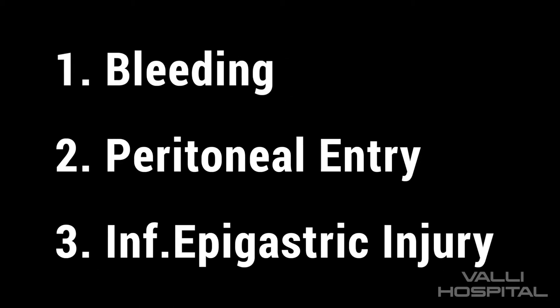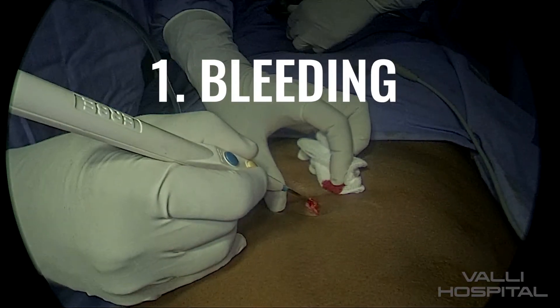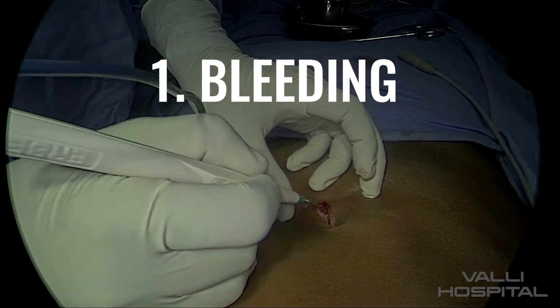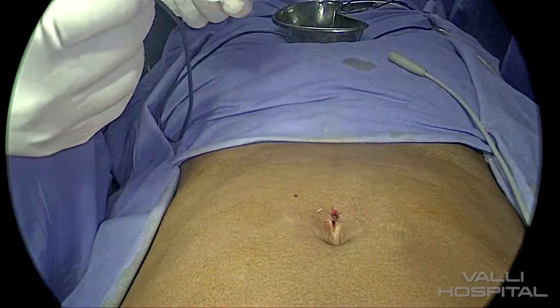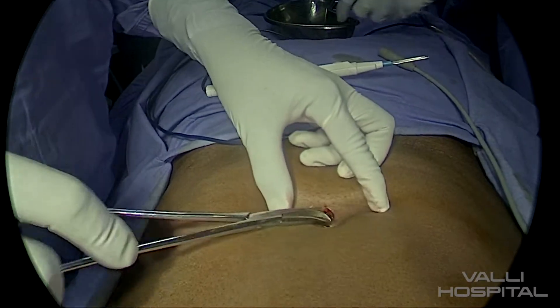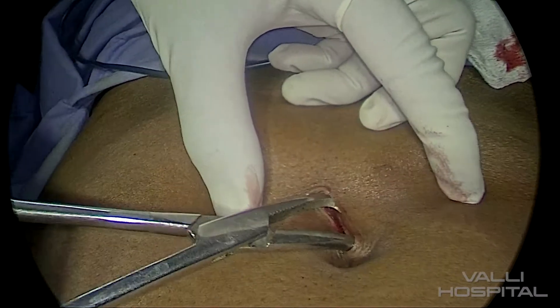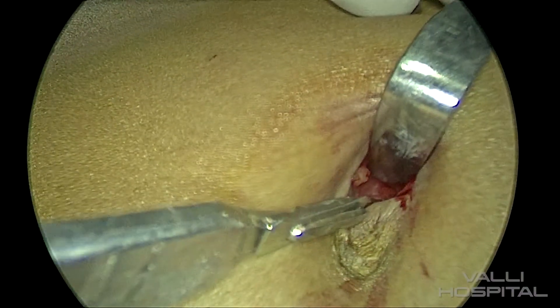There are mainly three difficulties you come across when putting the ports. Number one is bleeding. Number two is peritoneal entry, and three is inferior epigastric artery injury. Bleeding can occur at the skin incision or when you go above the inferior epigastric artery. In the skin, if there is bleeding, that can be controlled easily with the gauze piece. When there is a spurt, the gauze piece may not control, so in that case you have to use the diathermy.